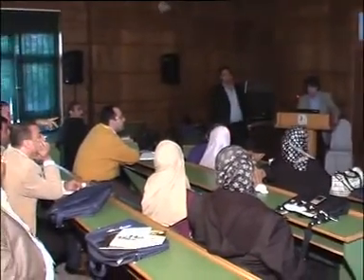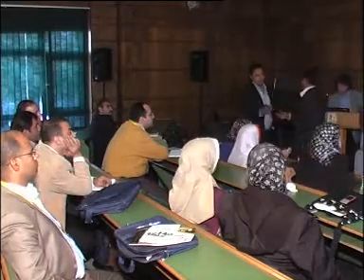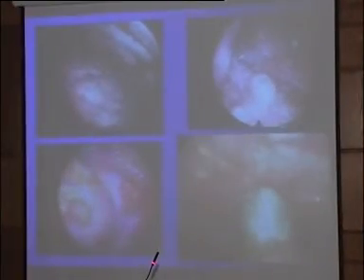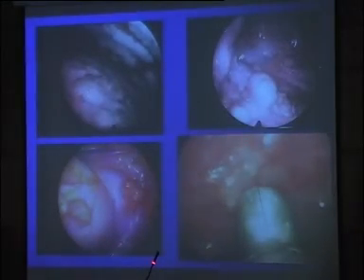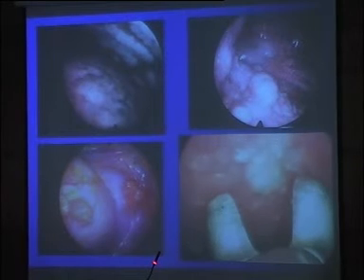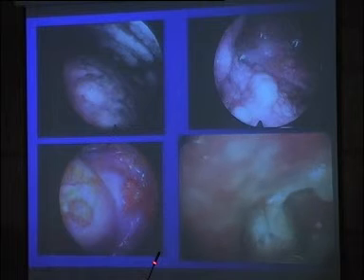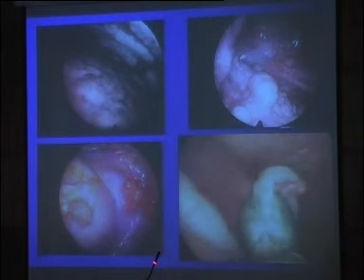Yeah, good question. Thank you for the question. It's important to see the detail. Okay? You said that we can see the ribs, but I cannot detect the ribs here. I usually used to peel the rib before I grasp. But you see, I grasp, and you peel. You see here the rib. Here, it is a rib. You see? No.